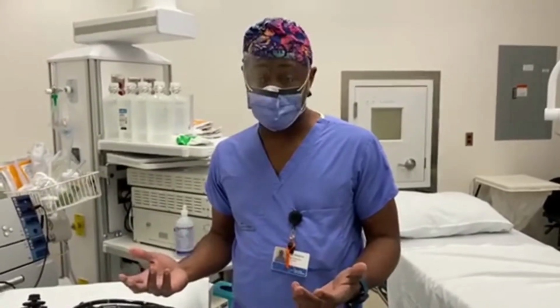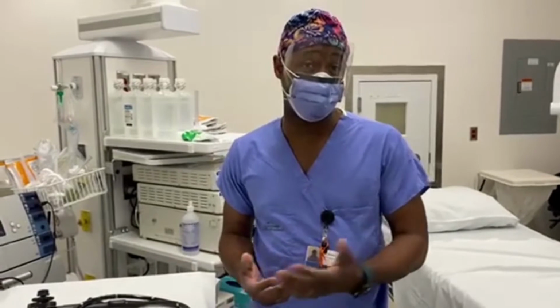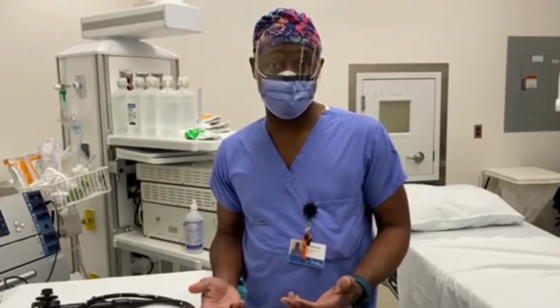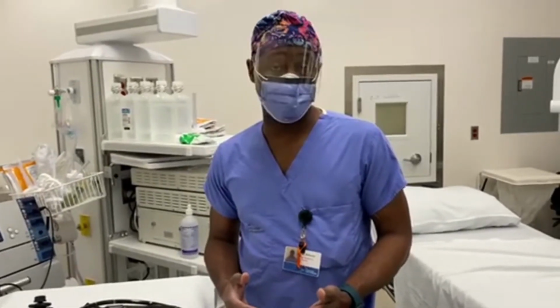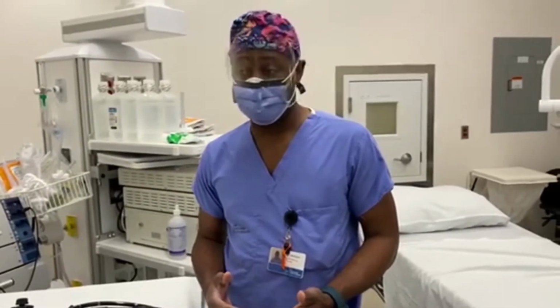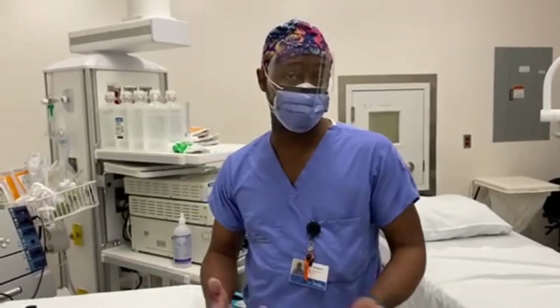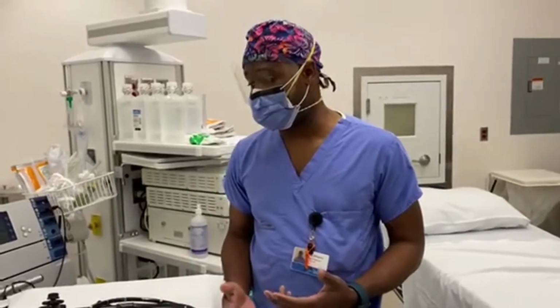The colonoscope does a similar type of function, obviously for the lower GI tract. We use it predominantly to assess that area, to look for diseases such as inflammatory bowel disease, Crohn's, and ulcerative colitis, but also to look for other important disease states, colon cancers, polyps, which is really important in the colon cancer screening program. And that instrument also allows us to take biopsies and, of course, remove the polyps and send them off for analysis. So those are the major procedures that we do here.